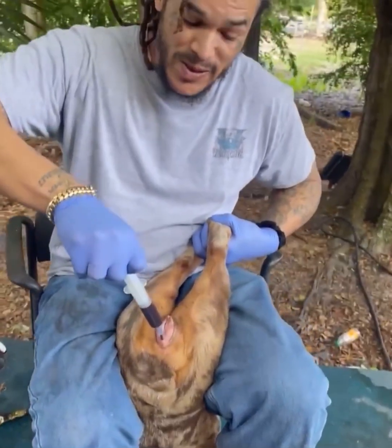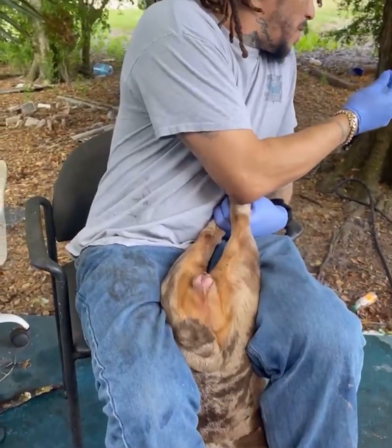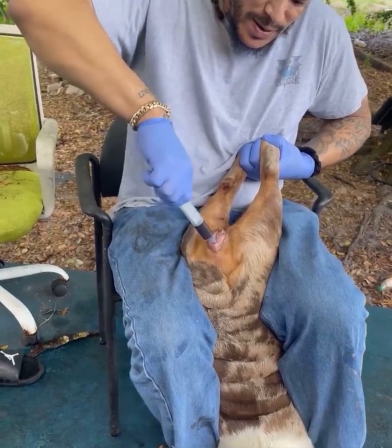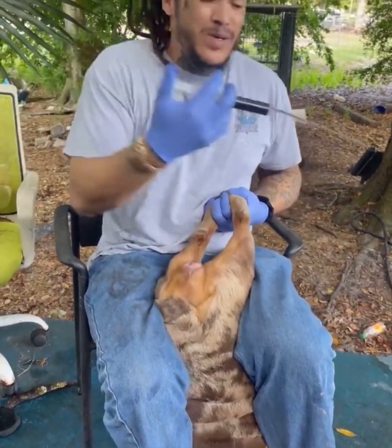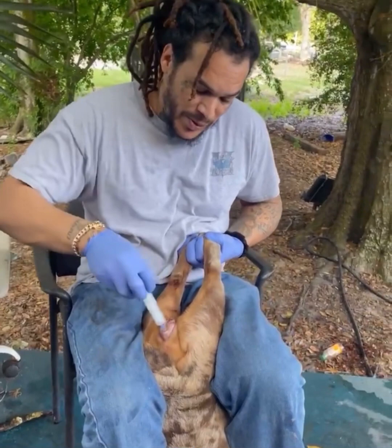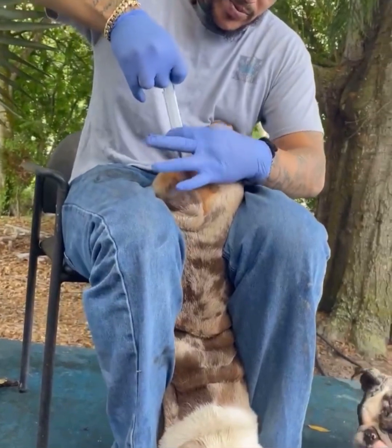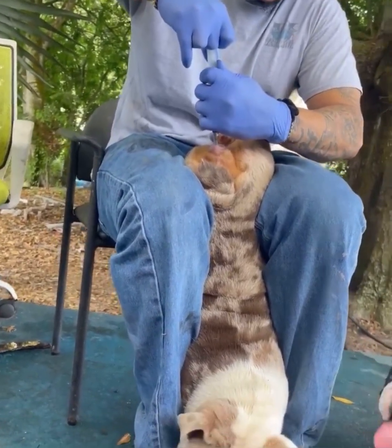So you're gonna stick the pipette in there — look at this, this is disgusting. We're gonna flush her out, get all of this out of her. Hold on Penna, hold on baby. There's a little discomfort for her because she's got a nasty infection. This right here can cause your dog to not be able to breed — I might even skip this breeding just because of this. I knew she had this problem because yesterday when I took her to do her progesterone test, she had some dark colored blood coming out of her.